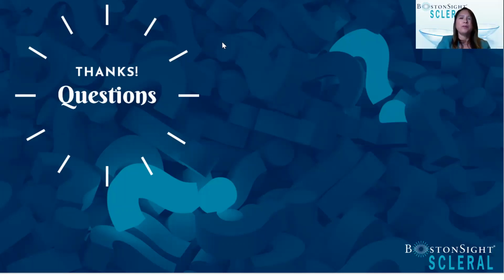It would be great. We couldn't find one, but for the audience, as I said, we do use the Burton lamp. And one comment about the parallax, I don't know if you guys experienced it. I think that's a great tip that you provided to our listeners, because in order to monitor progression, we really want to avoid parallax.